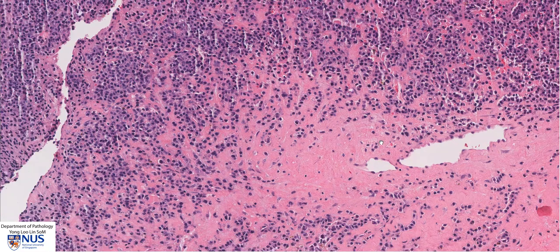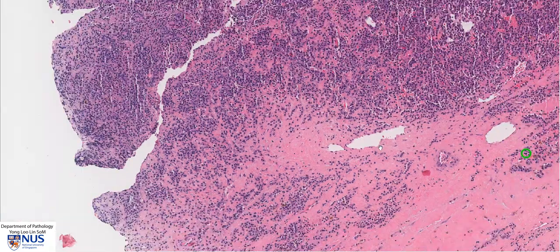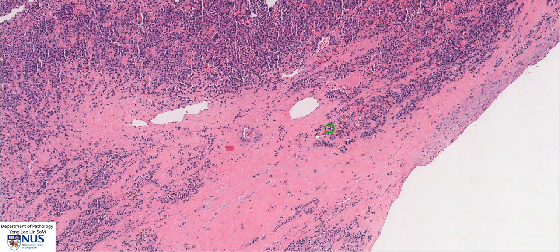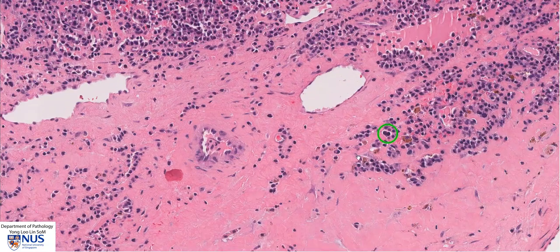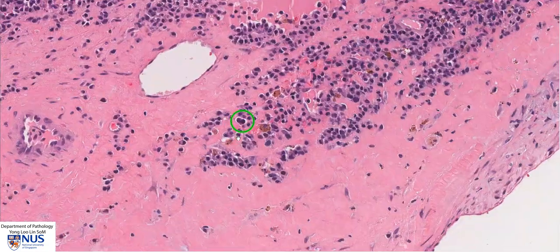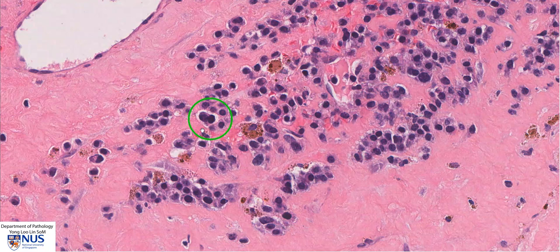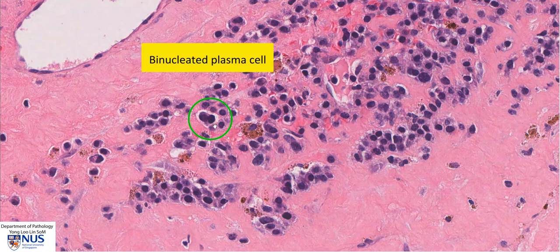In other instances, we can have more plasmablastic appearances where the NC ratios are higher. We don't really see a perinuclear hof and we can see more prominent nucleoli. Over here, we can see a feature that suggests a neoplastic population of plasma cells, and this is binucleation.